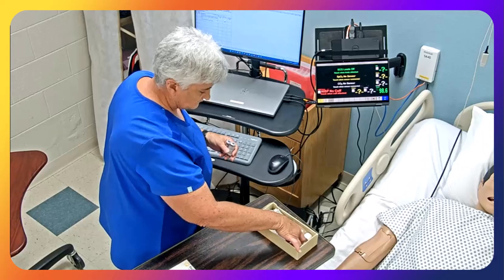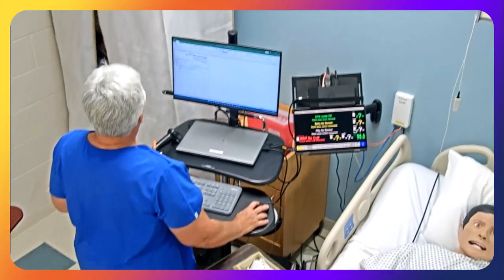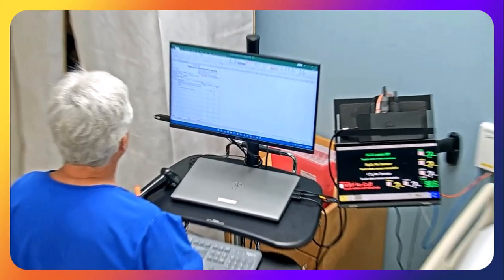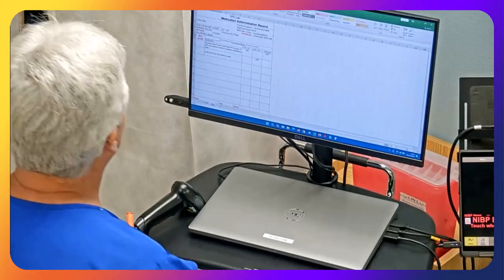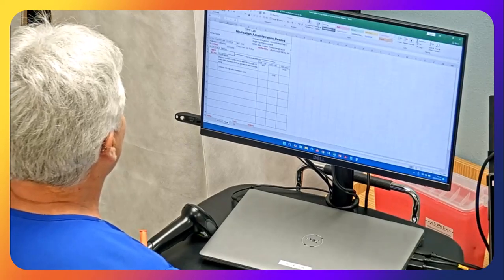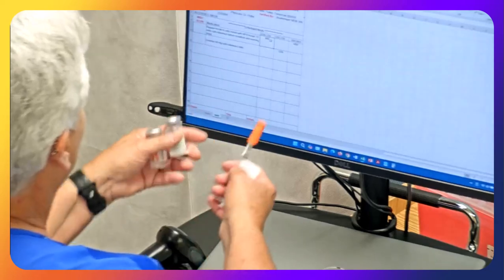Okay, so I've got Anna Taylor, date of birth 4/24/1991, no known drug allergies. I've got regular insulin 8 units mixed with NPH insulin 12 units, subcutaneous before breakfast and evening meal. I'm going to be giving the 9 o'clock dose.